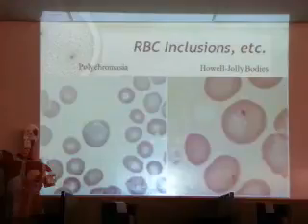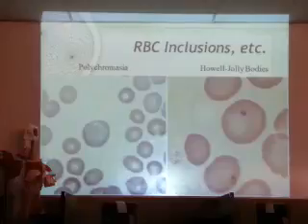So when you begin to see a lot of these purplish large cells, we call it polychromasia, we tend to think active bone marrow red cell production. Maybe this is in response to anemia or hemolysis or bleeding.